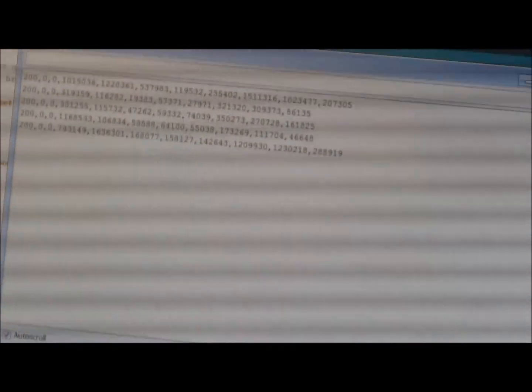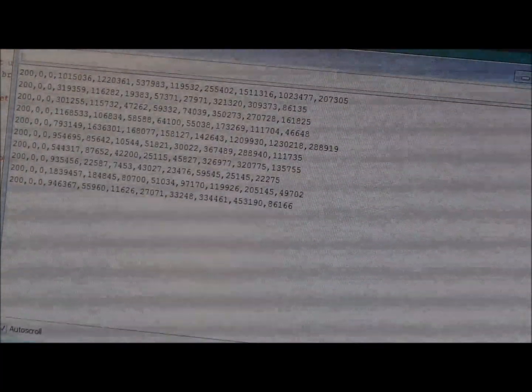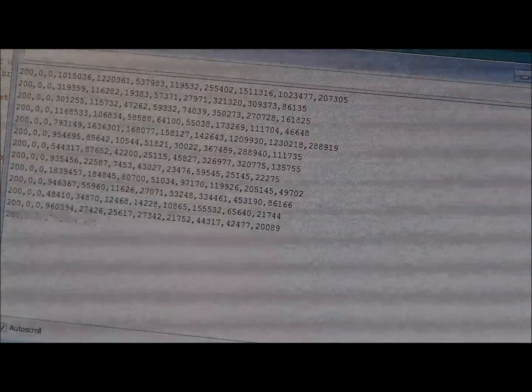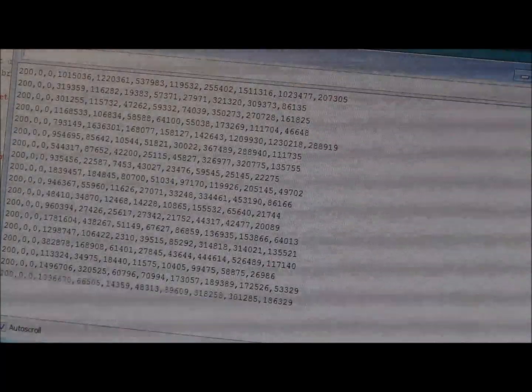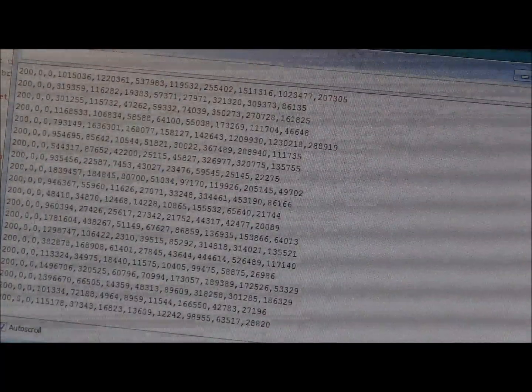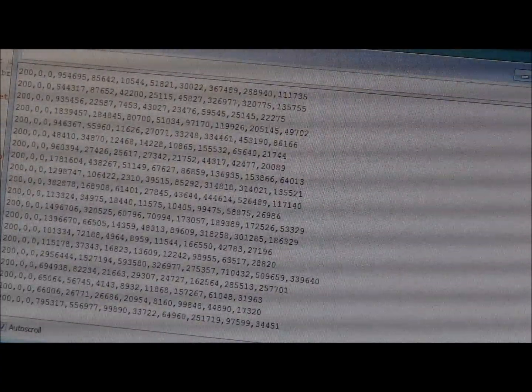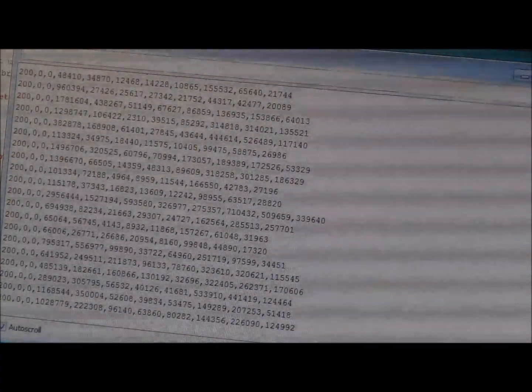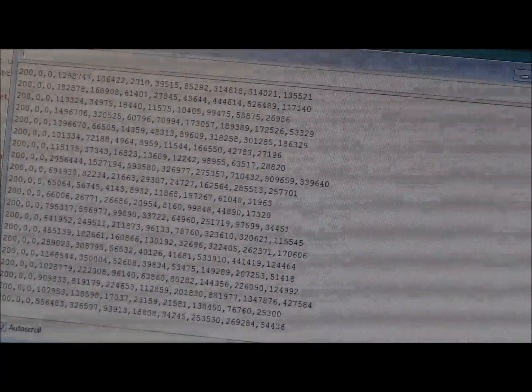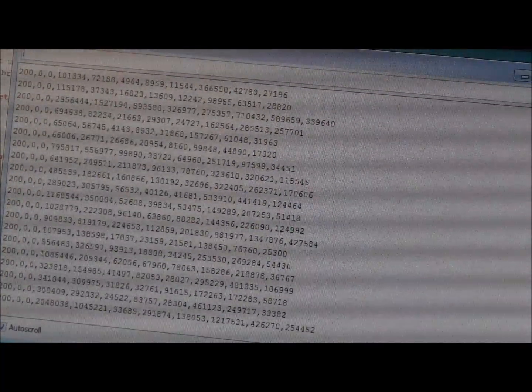Hopefully, with any luck, that is serial data coming from the different brainwaves from the MindFlex headset, and the Arduino is just doing a stellar job at decoding the serial data at 9600 baud. Couldn't ask for any better than that. You get about one sample per second resolution on these. Not the fastest, but for the price point and for this project, they're gonna do just fine. So I'm gonna see if I can get a graphic display of this setup, and we'll continue from there.